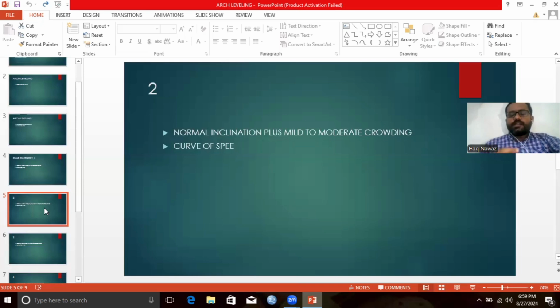By doing IPR, we have aligned our anterior 4 segment incisors. Our right and left posterior segments are also aligned on heavy wire, bypassing the incisors with an archwire sleeve so that it doesn't irritate the patient. So in our category 2 patients having mild to moderate crowding, we started the case focusing on relieving the mild to moderate crowding and aligning the arch.